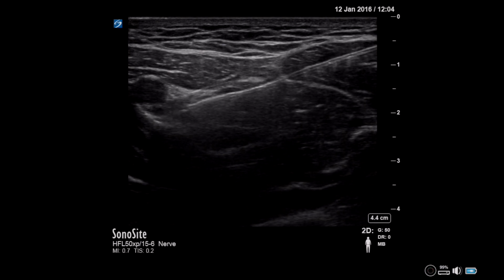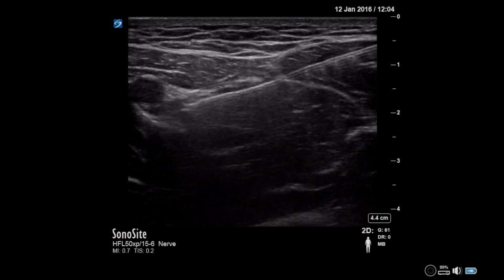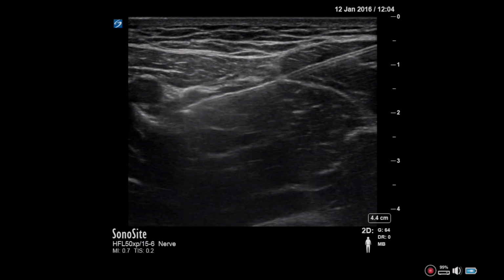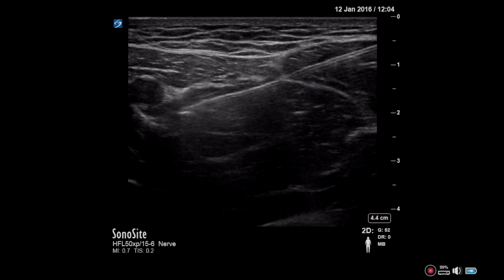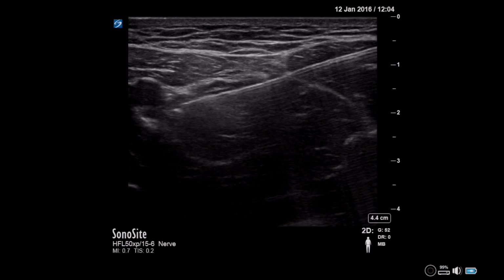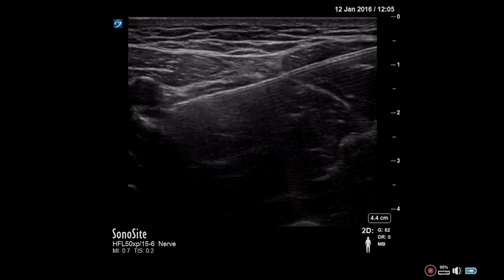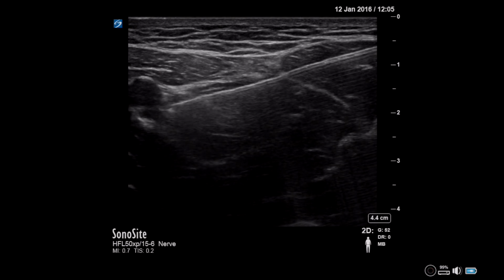The final resting point for the tip of the needle should be the inferior lateral aspect of the superficial femoral artery. Again, be conscious of the superficial femoral vein and carefully aspirate for blood every 5 ml of local injected. You may choose to inject the full 20 ml of 0.5% ropivacaine in this location, which in most cases is sufficient to ensure good spread within the canal.